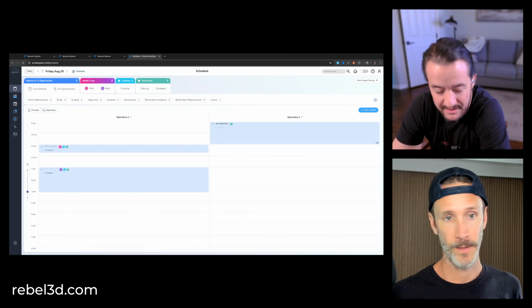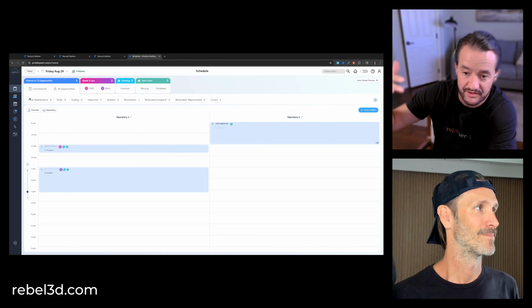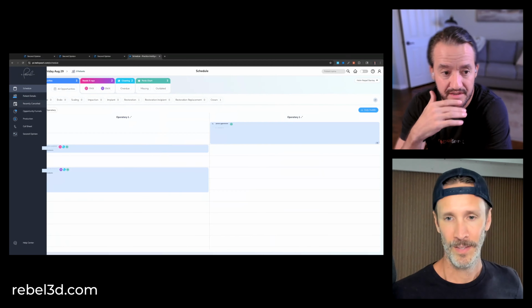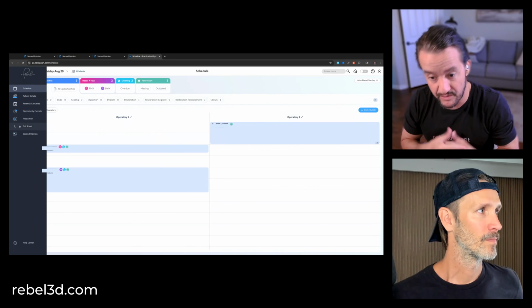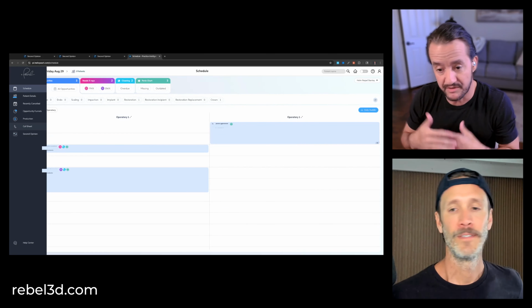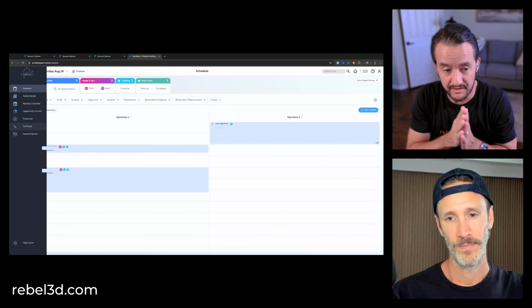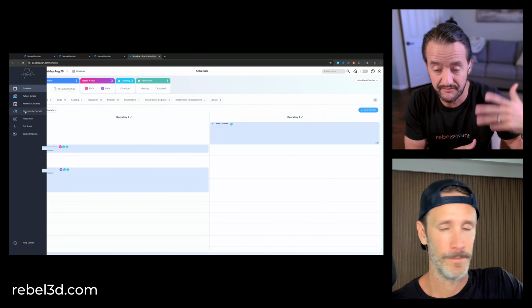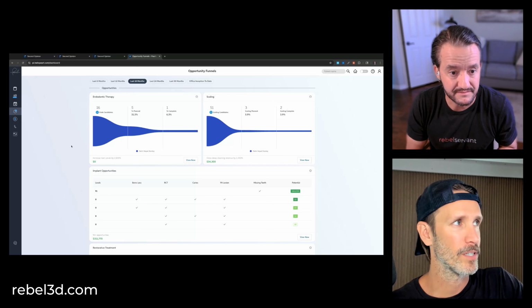Yeah, it's like an accountability partner for making sure you're at least addressing all of these potential concerns. Without Pearl, you may have looked at the radiographs and only seen one, or maybe you saw two, but now you have to manually make a note somewhere, go put it in your schedule. But this is just feeding that data saying, hey, there's 3 opportunities here. How are you going to handle them? Yeah, exactly. It's totally up to the doctor.